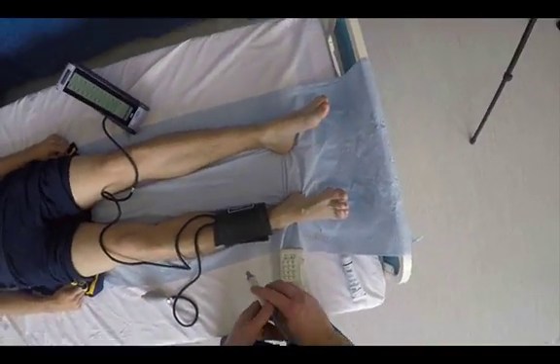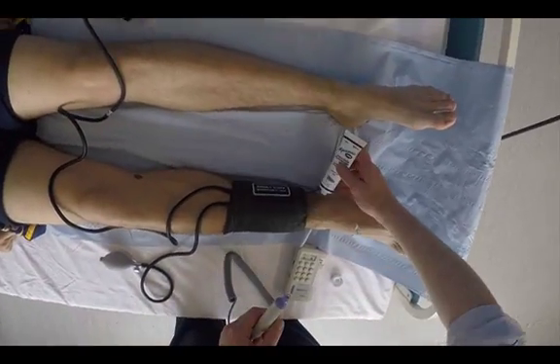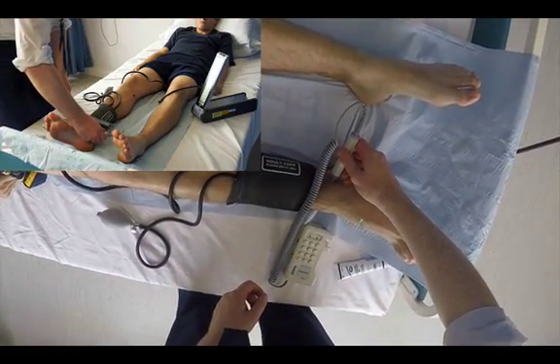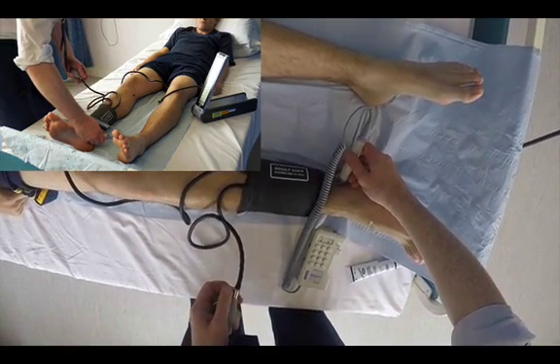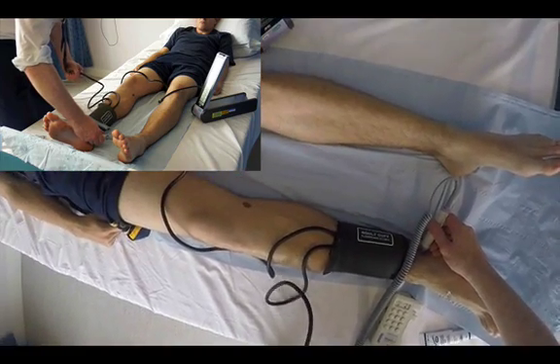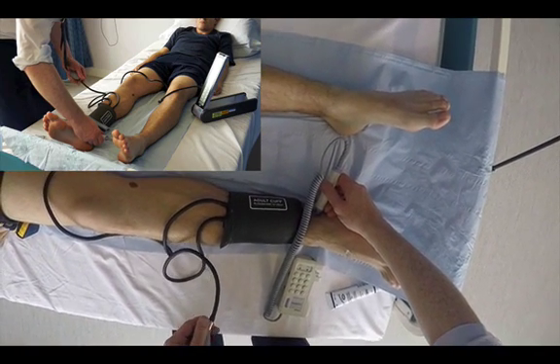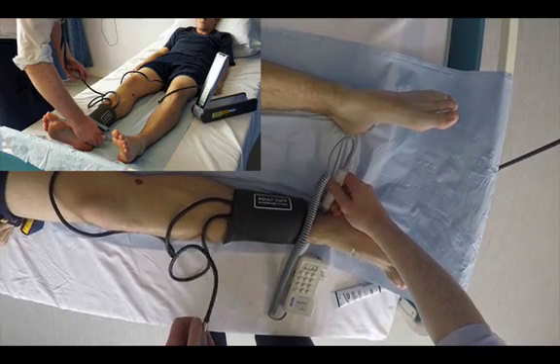We repeat this for the other foot artery — the posterior tibial vessel — using exactly the same procedure: find the vessel, insonate it with the Doppler probe, and inflate the cuff to obliterate the signal. Once the signal comes back in, you go above it again and come down more slowly to fine-tune the reading — exactly the same way you do a blood pressure in the arm. The posterior tibial pressure was again 130 mmHg.